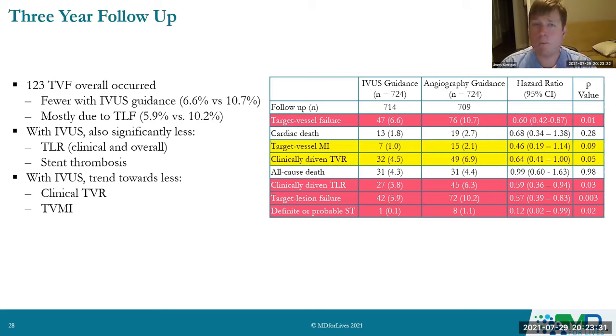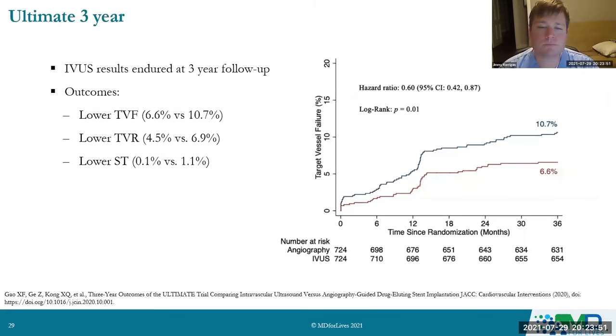So now, before this, I couldn't counsel patients on this. Now I do. I talk about using a small camera, an ultrasound inside the blood vessel to make sure the stent is the right size and that we treat the blood vessel appropriately in order to make sure that the stent stays open as long as possible, to reduce the chances of it re-narrowing or that a blood clot forms inside the stent, when I consent my patients.